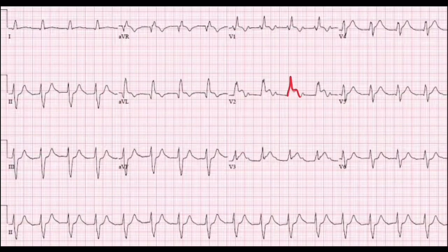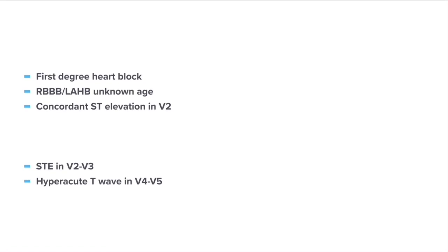In the second ECG of the same patient, we can see ST elevation in leads V2 and V3, and a hyperacute T wave in lead V4. The findings are: first degree heart block, right bundle branch block (RSR' pattern in lead V1), slurred S wave in leads I, AVL, and V6, QRS duration of more than 120 milliseconds, left anterior hemiblock with left axis deviation (QR pattern in leads I and AVL, RS pattern in leads 2, 3, and AVF), and ischemia suggested by concordant ST elevation in leads V2, V3, and hyperacute T wave in leads V4 and V5.